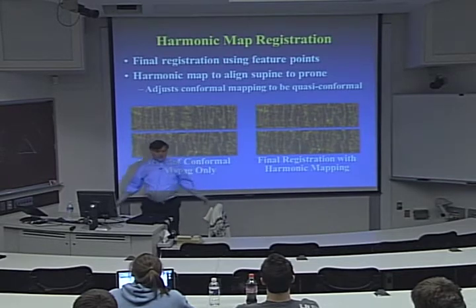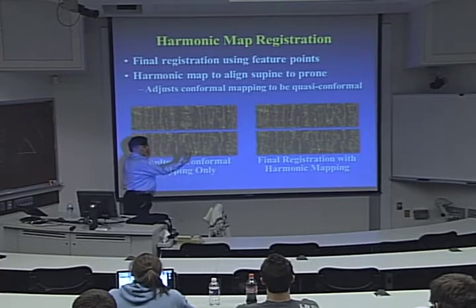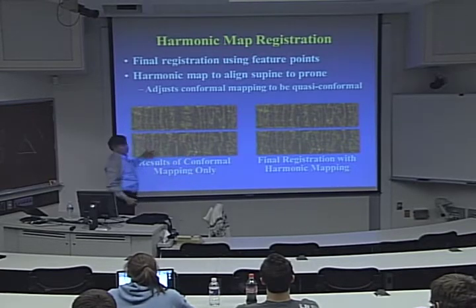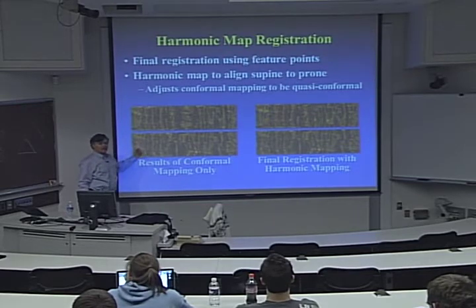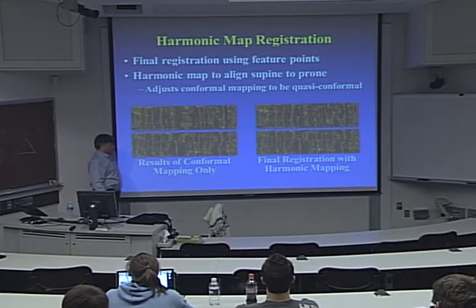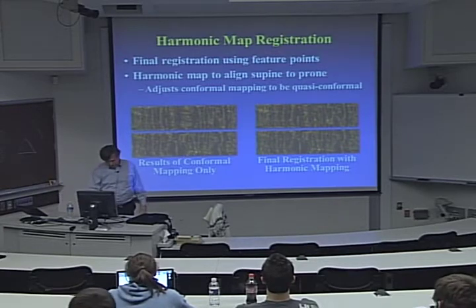By the way, this is also a way to examine the colon. You have the entire colon open in front of you, and you don't have issues of any hidden parts, no haustral folds or bends hiding parts of the colon. But the doctors don't particularly like this way of looking at the colon. Maybe they'll get used to it.